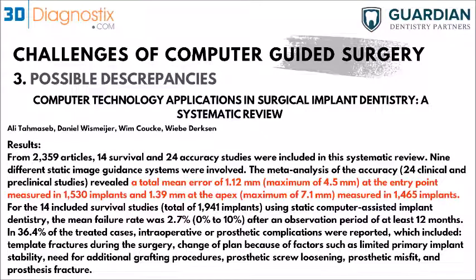So this is just to explain that even with guided surgery, you should anticipate that you might have some discrepancies. Even though it is guided and everything should be set according to the plan, you might have some changes. So I think this concludes the presentation today. We can still wait for some questions if you have any.